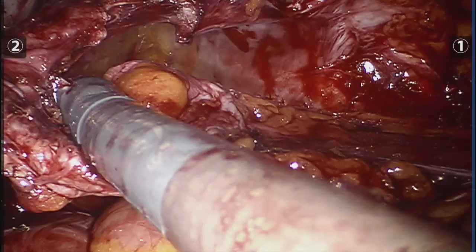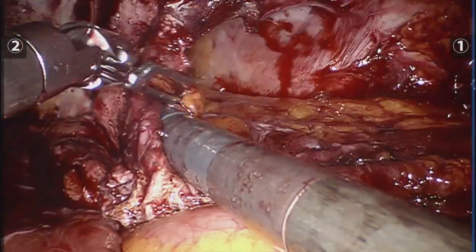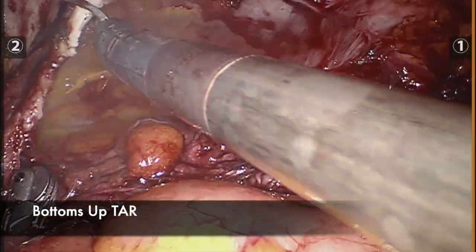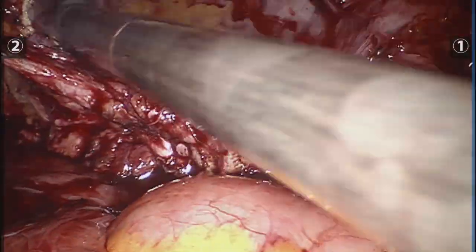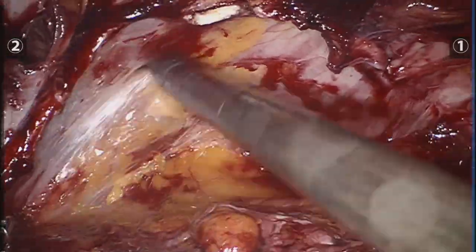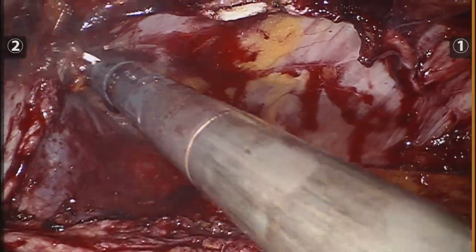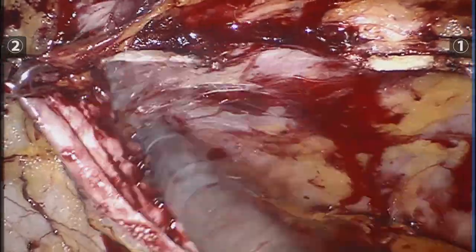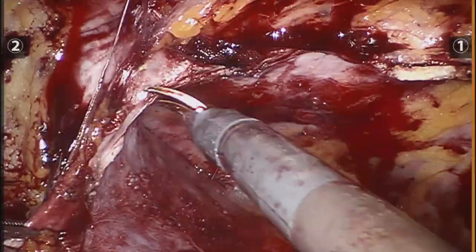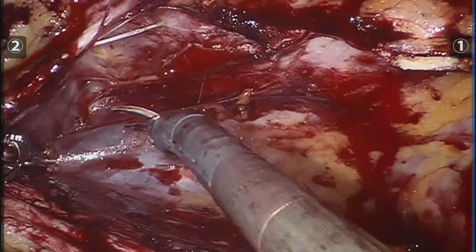Again, words of professors from the IHC coming to mind: go lateral, come back medial, dig a cave — and then it just progressed from there. Once I reached a point where I didn't feel comfortable advancing because I started making a few holes in the peritoneum, I went to the other side to start the TAR top to bottom and then connect the dots.